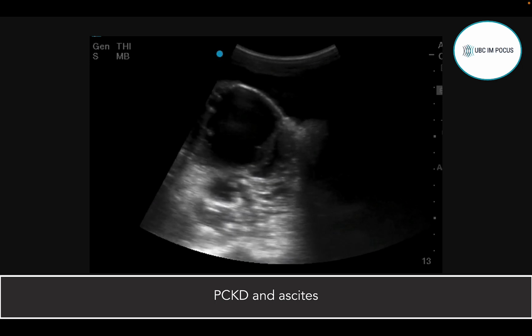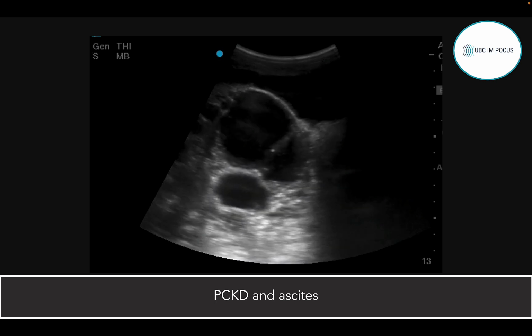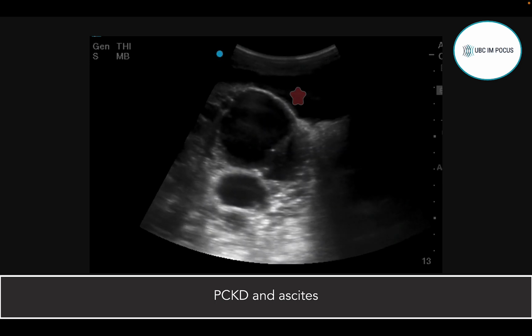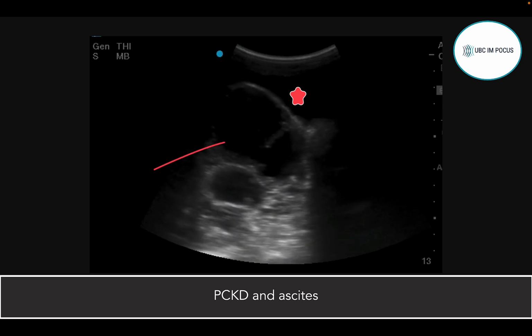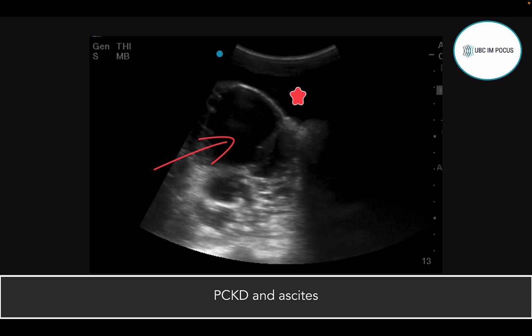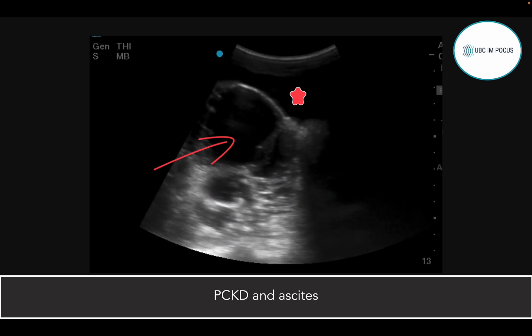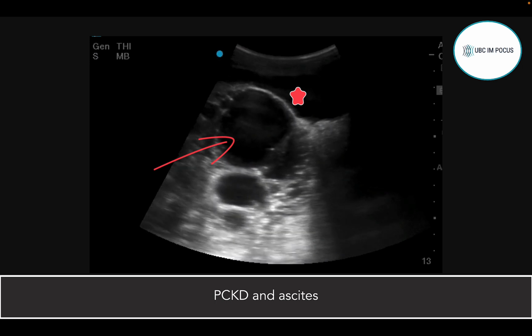This is an example of something that I would not poke, especially that larger pocket in the middle there. We can see there's a few areas of black or anechoic areas in our picture here. There's some anechoic fluid at the top of the screen that probably is ascites. But as we move down the screen, we see these rounded encapsulated areas that are concerning and certainly don't look like free-flowing fluid. They could be highly complex cysts. In this case, this is a patient with polycystic kidney disease. Ascites shouldn't be rounded, geometric, encapsulated. That's the take-home point here.